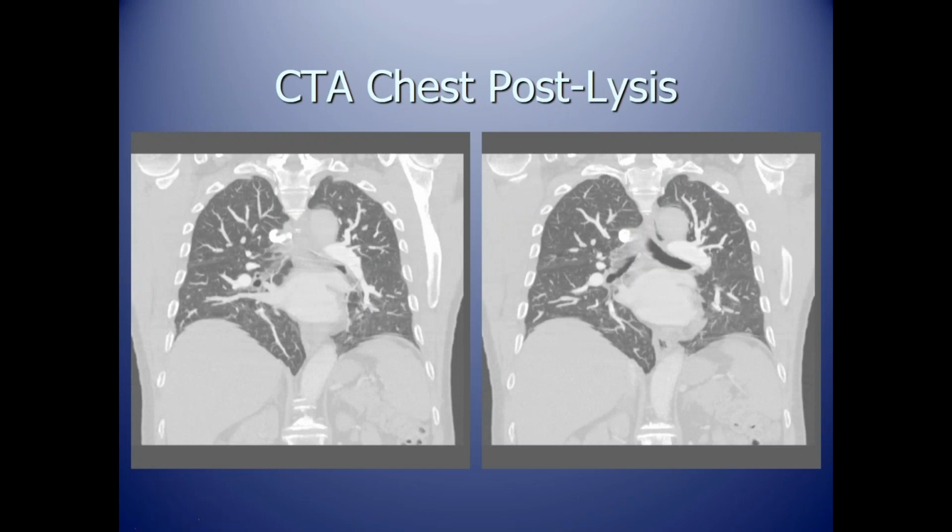Just mind you, although we see that, that is not a driving endpoint. We do not go for complete clot dissolution. Really, the key for this procedure is reversal of RV dysfunction. That's the one that's the independent predictor for mortality. Clot burden is not.